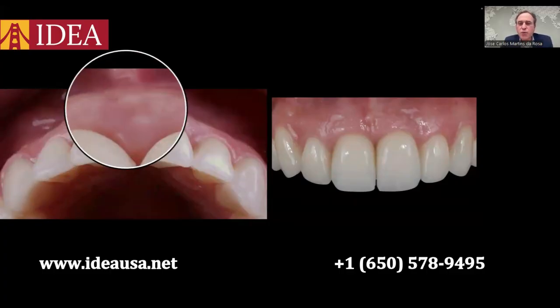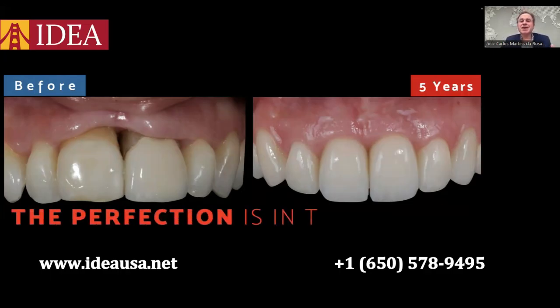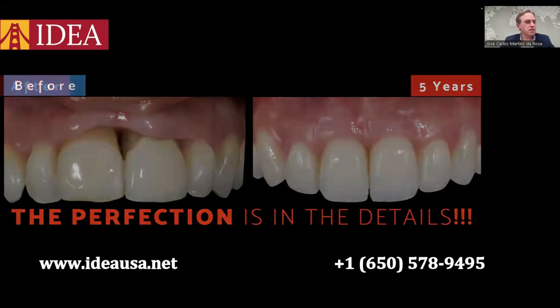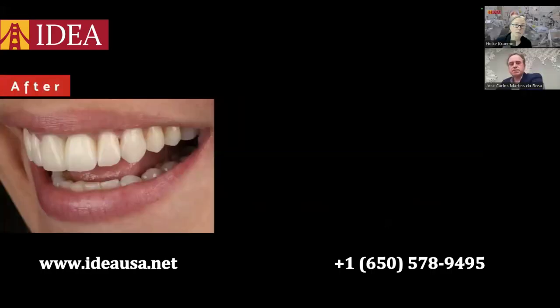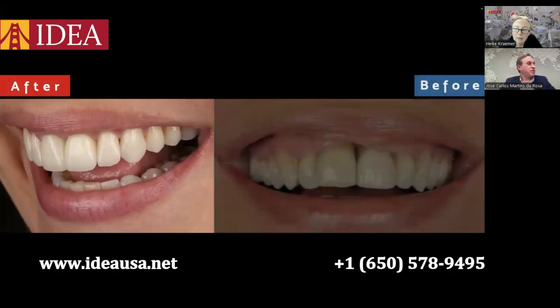And this is before and after. We had a nightmare in the beginning, a breakdown in the esthetics. Now you can see the balance between the gingival architecture and the final porcelain restoration. So the perfection is in the details. So this is the outcome after. Make a comparison with how everything started.